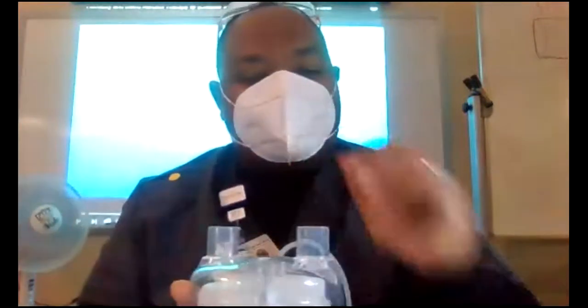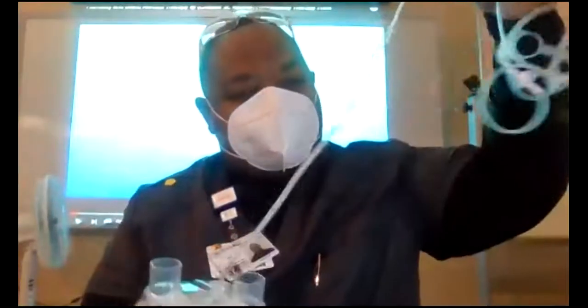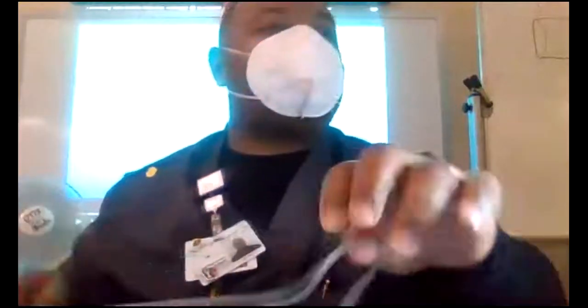But if you see a test question that says the Passover with the tower on it is now called a cascade, okay? Now we heat from the bottom instead of the top, all right? Now this is a cascade humidifier. Now, how does the water get in here? The water is fed in through a feed apparatus, right? And it goes into a little bag. Where's my bag? See this bag here? What does this sign say?